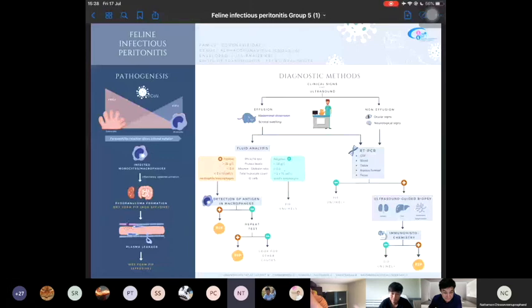Group 5, would you mind answering the question? The question is, can we use the canine coronavirus strip test to diagnose FIP? Currently, there is no feline coronavirus strip test on the market. So there are two questions. First, can we use a canine coronavirus strip test to test for feline coronavirus? And second, whether that strip test gives any result on being infected with FIP.